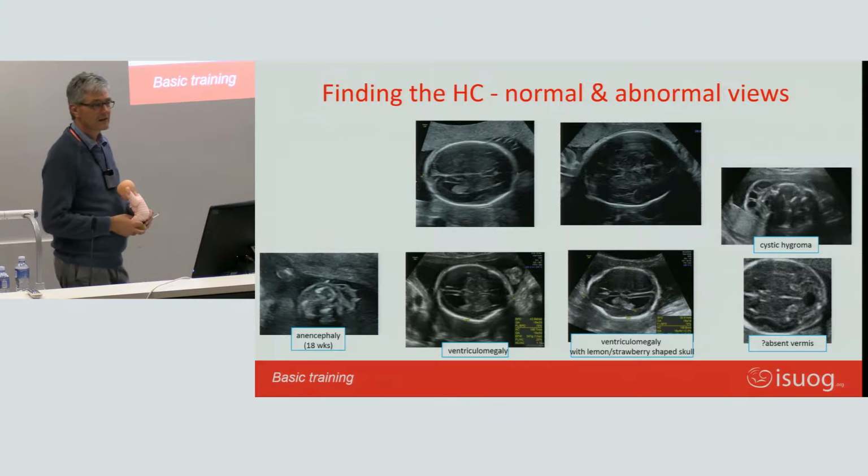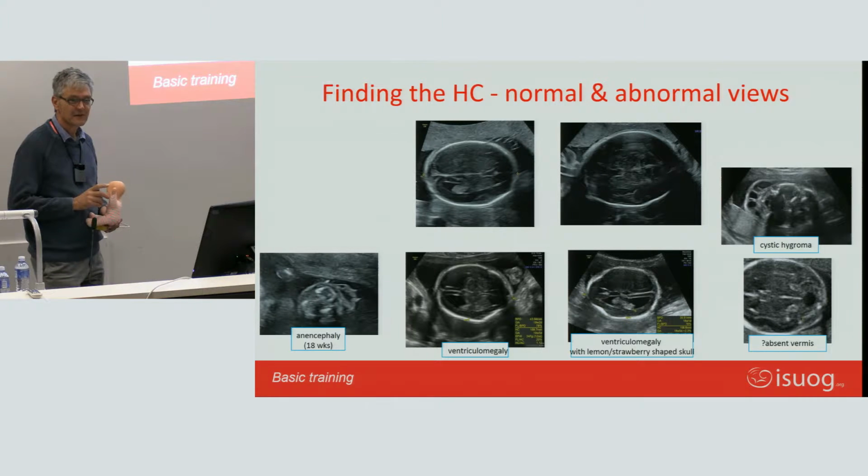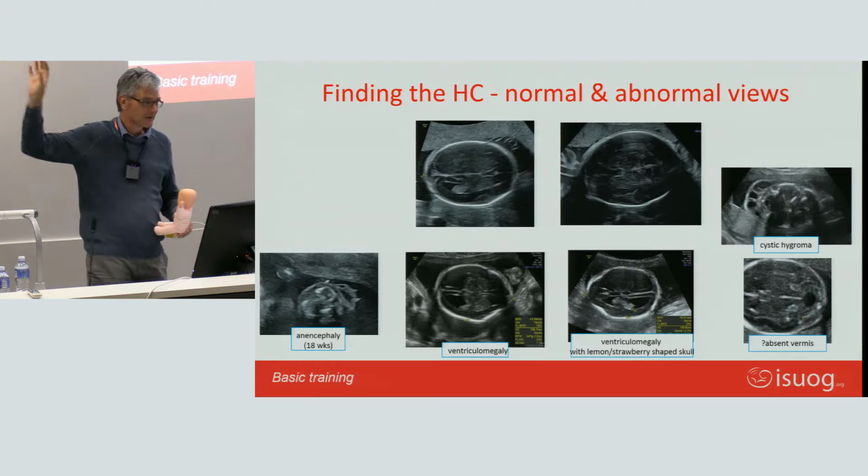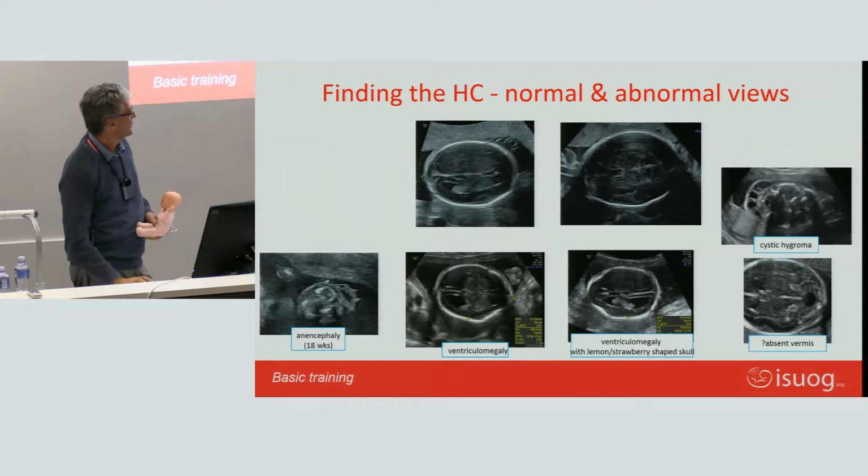Right, it's a couple of things, not holoprosencephaly though, but keep that question parked somewhere at the distant corner of your mind. We'll come back to that.